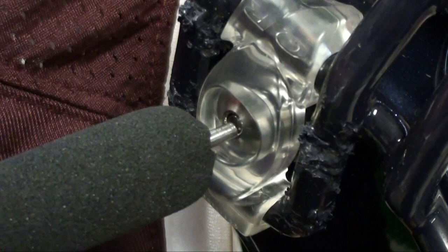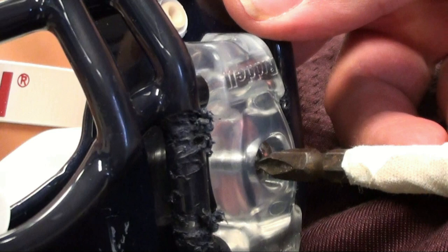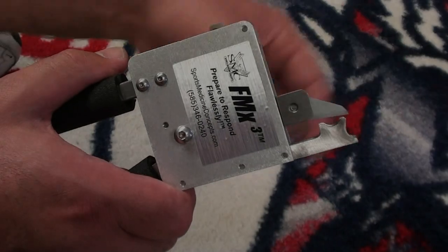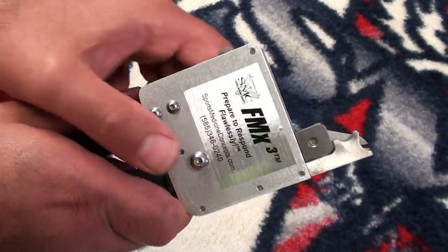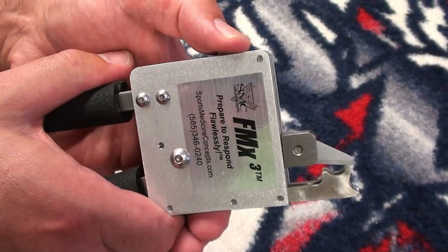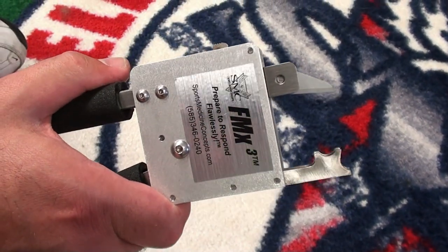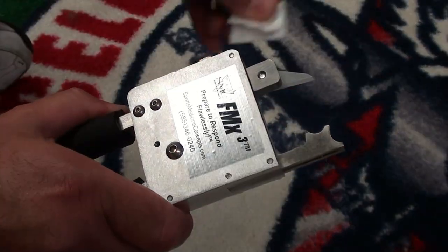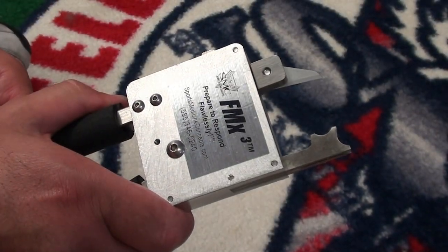In the event that attempts to remove the bowtie fastener using the quick release system or a power screwdriver are unsuccessful, reposition the FM extractor to cut the fastener from the helmet. Begin by removing the protective safety blade cover from the FM extractor. With the FM extractor completely closed, choose either the two or four step ratchet setting. Next, use the release lever to open the opposing ends of the FM extractor and lubricate the blade with the FM extractor lubrication wipe.